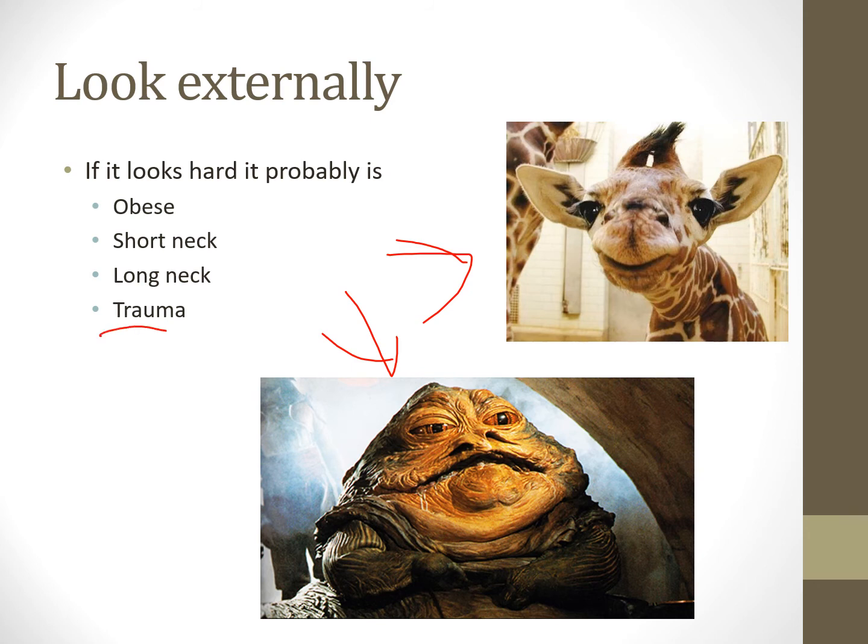Trauma, any trauma to the airway, we might want to do a direct visualization technique where we actually use one of the cameras, whether we use a bronchoscope and put the ET tube over the bronchoscope and intubate with it, or we might want to use a glide scope or CMAC or any of those other ones out there that are video intubations. We might need to use that, especially if the airway is bloody and traumatic.